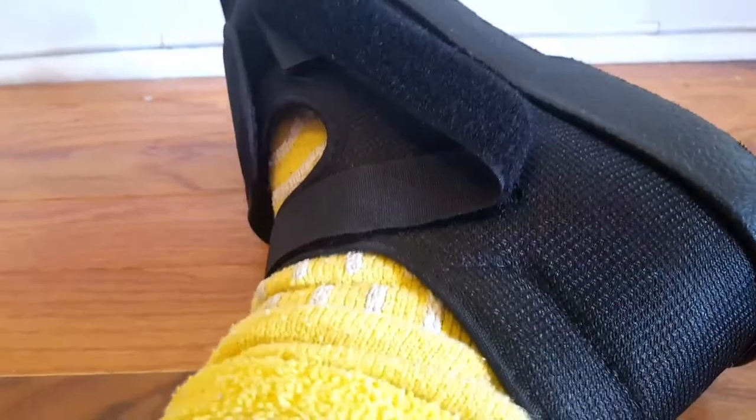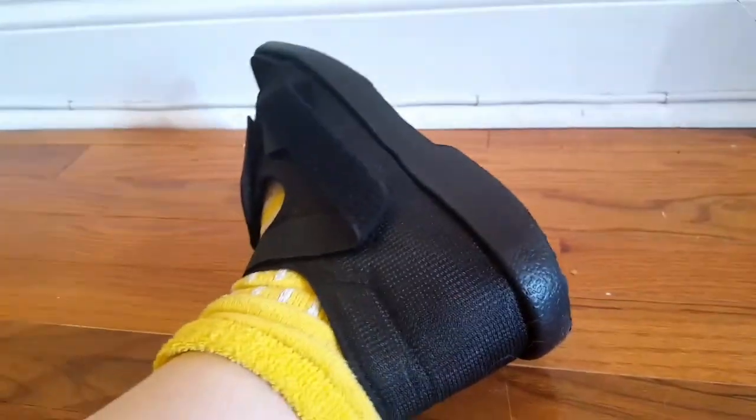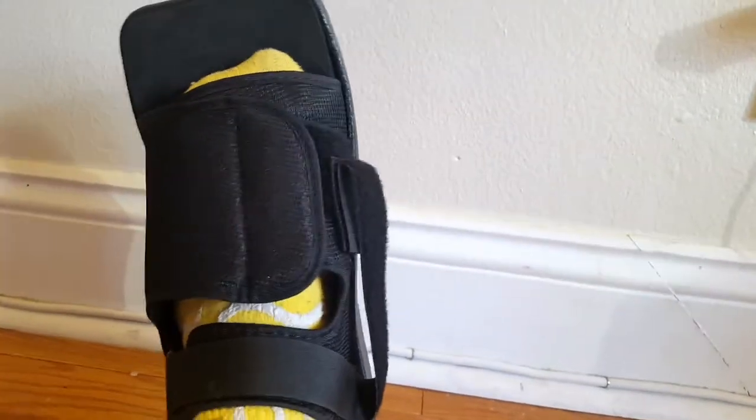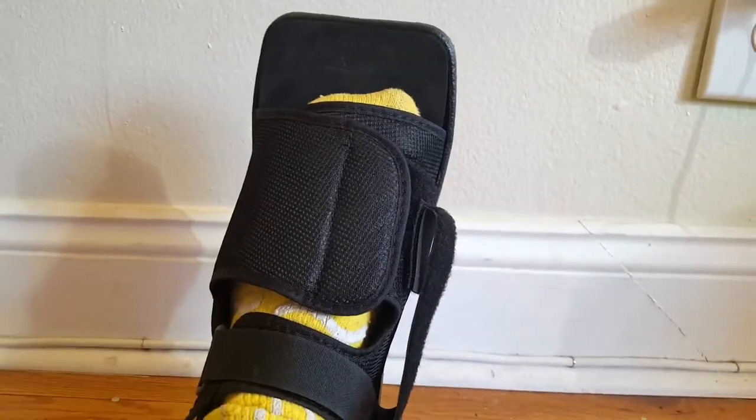The ankle straps are adjustable, so you can make it a little tighter using the velcro. It took some time for me to get used to, but my feet don't slip and slide inside it, which is really important especially with the large toe gap. Definitely look into this one if you're looking to take the pressure off your toe when you've fractured or sprained anything. This is great.